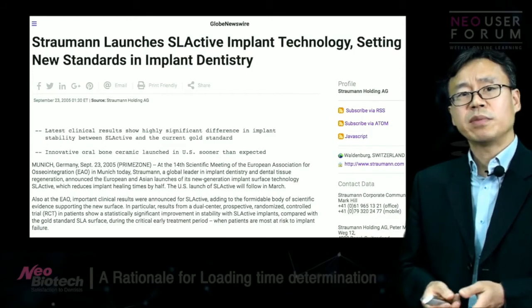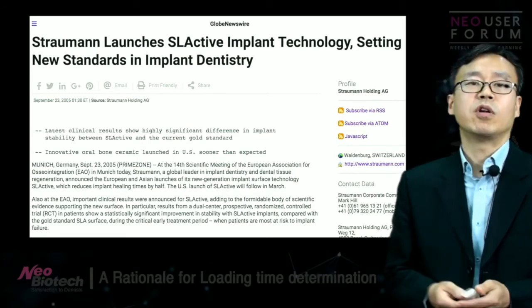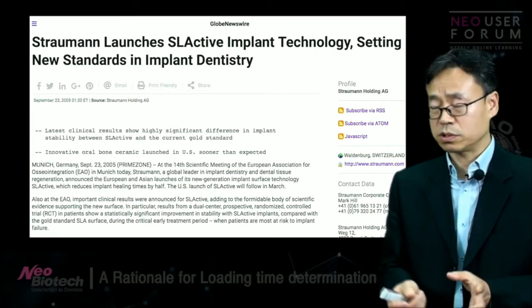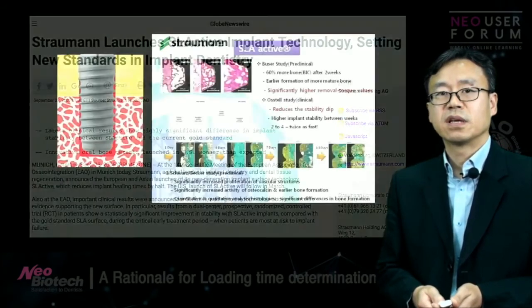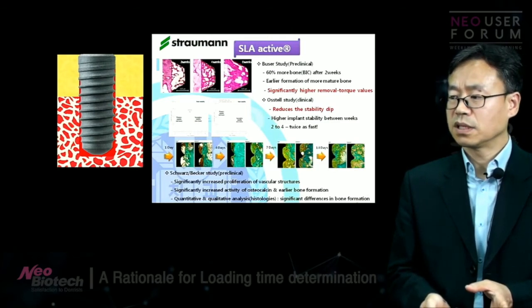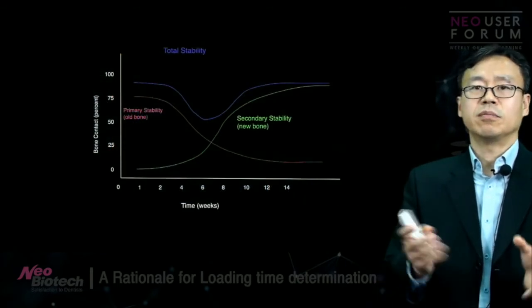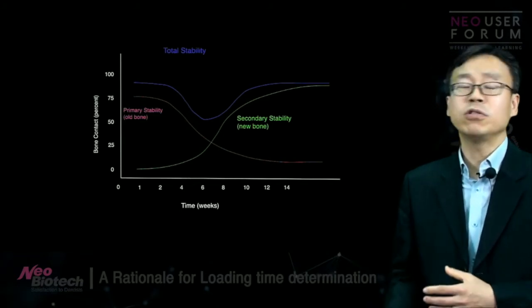4 weeks is what Straumann has been insisting is needed before loading. In the year 2005, they launched a new implant with a new surface, which was called SL Active. What they claimed was that by improving the implant surface, they can induce much faster new bone formation, which in turn makes the whole healing process faster so that they can load faster.